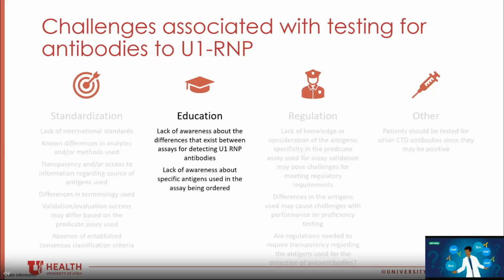In addition, there is a lack of awareness about specific antigens used in the assay being ordered. I would like to challenge each of you to help in addressing this issue by determining which antigens are used in the assays offered by your laboratory and whether that information is easily available. And if not, reaching out to your laboratory about making it available.